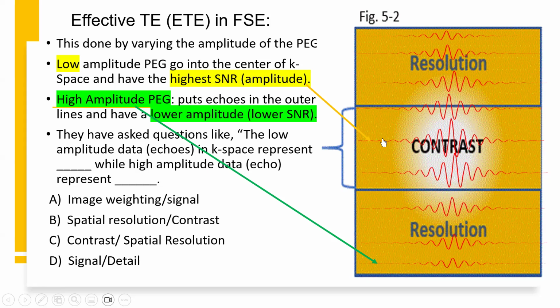They've asked this question. That's why I threw it in here. I wanted to go over it because you look at this and you go, holy crap, Batman. Whenever you turn a gradient on in MRI, you screw things up. You make tissues dephase. When they dephase, they have a low signal to noise.